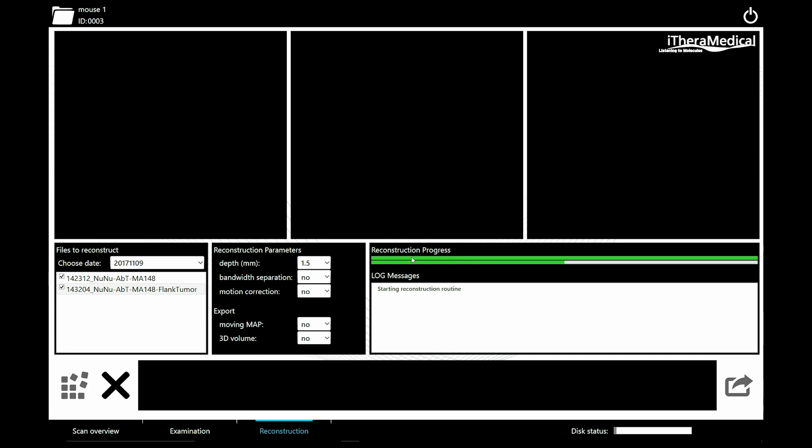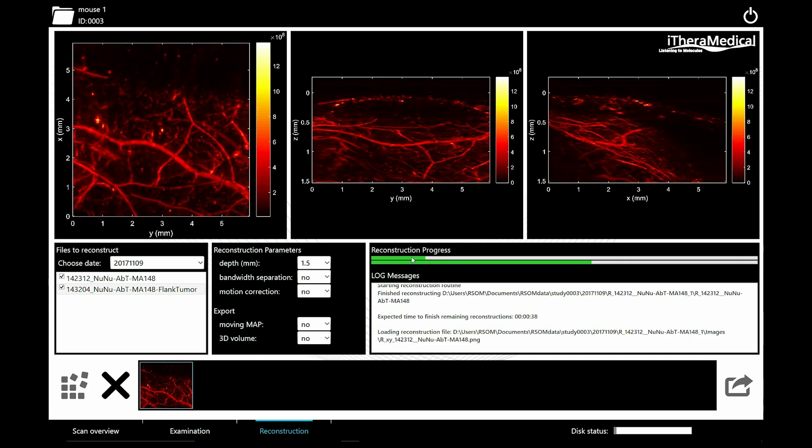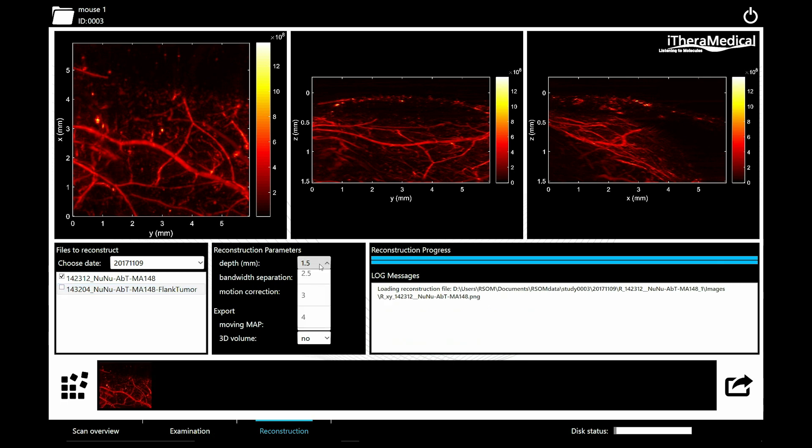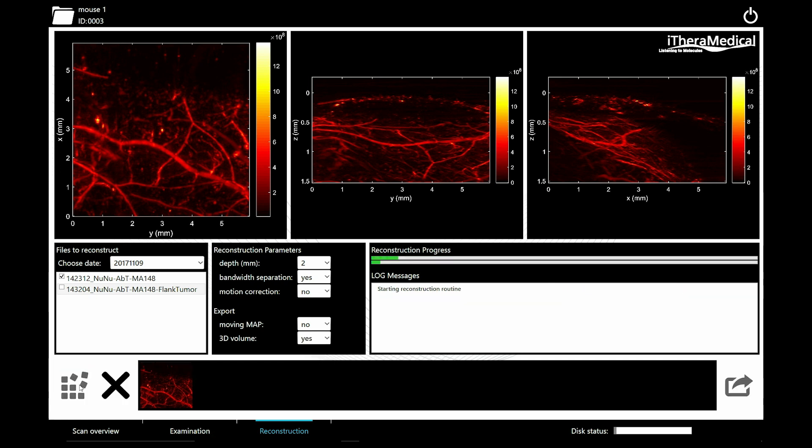Finished reconstructions will be visualized automatically in View RSOM. For improved visualization and post-processing, additional options such as bandwidth separation and motion correction are available. Images can then be exported.